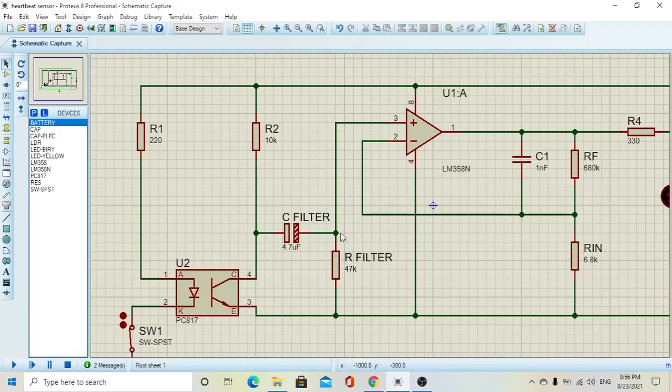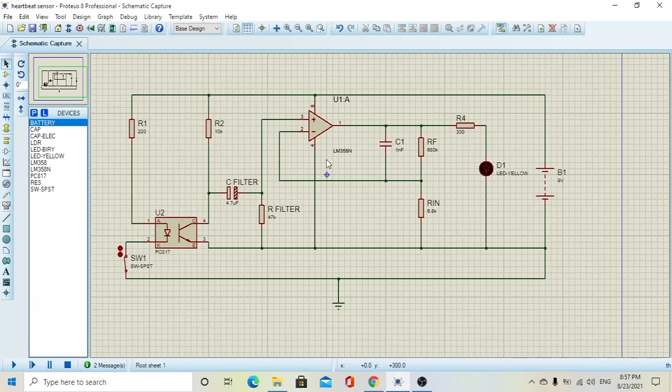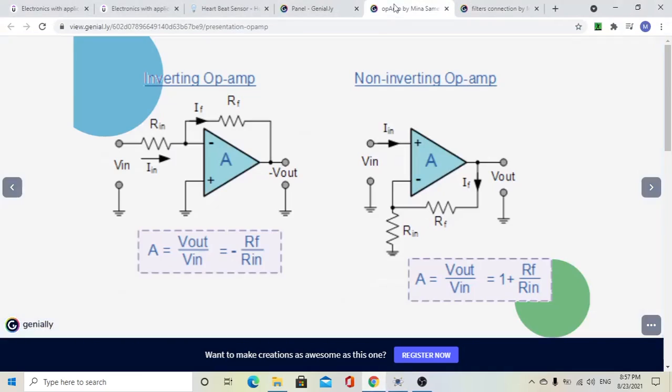The signal goes to the amplifier — we have right here an LM358 amplifier. This amplifier has pin number 3 and pin number 2 as the inputs, pin number 4 and pin number 8 as the supply pins, and pin number 1 as the output. Recalling the amplifier configurations from previous lectures, we are going to connect the circuit in the non-inverting operational amplifier method.